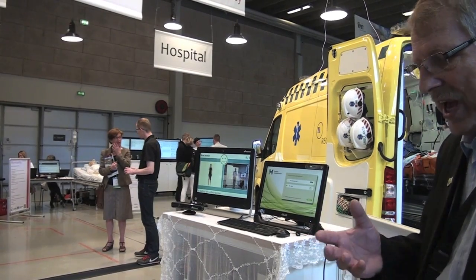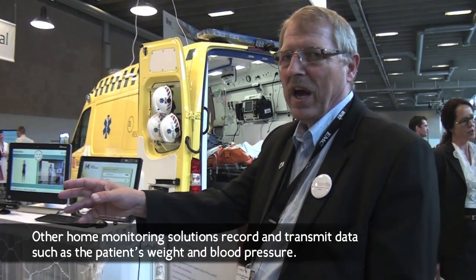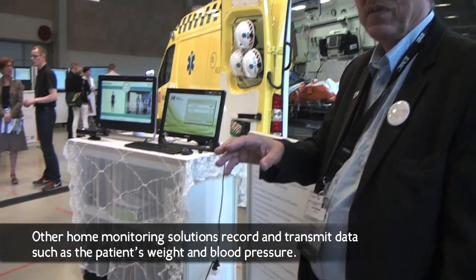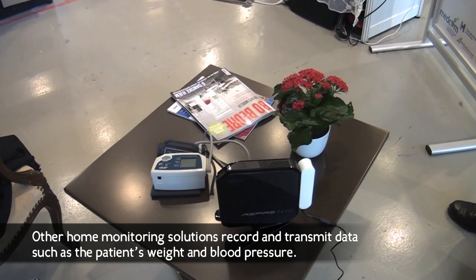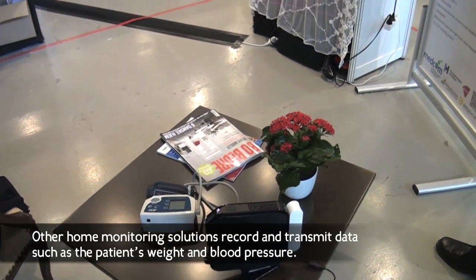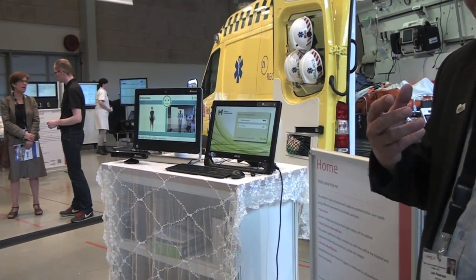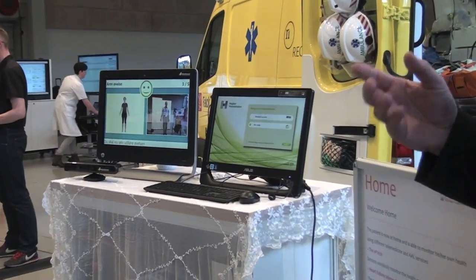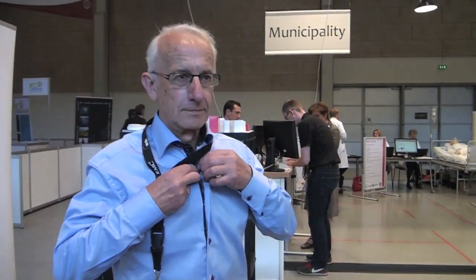Also in the home we have some home monitoring system. We have the weight and the blood pressure that the patient is able to do self-monitoring at the home. Same system, same setup, sending it to a central database where it can be monitored, in this case by the hospital staff. We can see that the patient is wearing an e-patch.